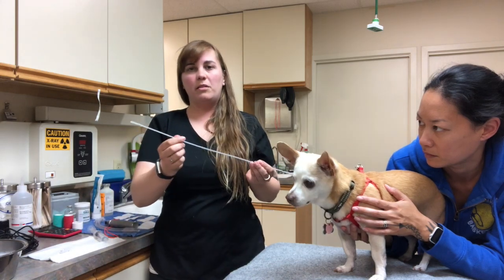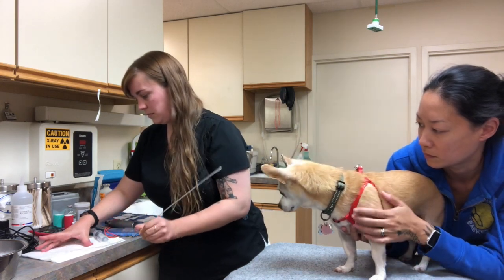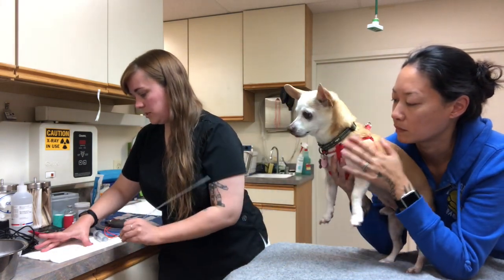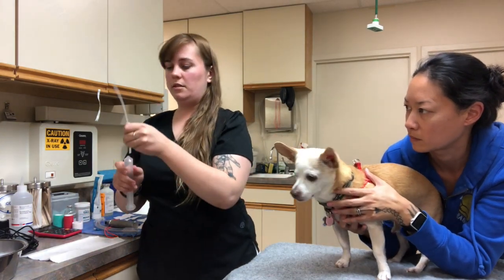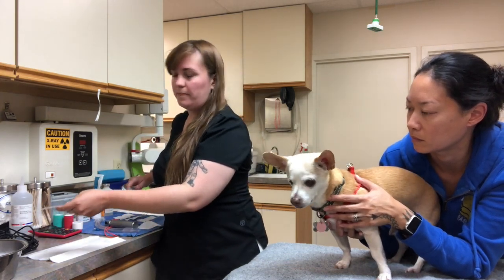And I'm going to lube up about the bottom quarter of our catheter. You want to lube it up nice and well. That way you're not going to meet too much resistance going in. Attach it to our catheter, and I'm actually going to prime our catheter with our solution.